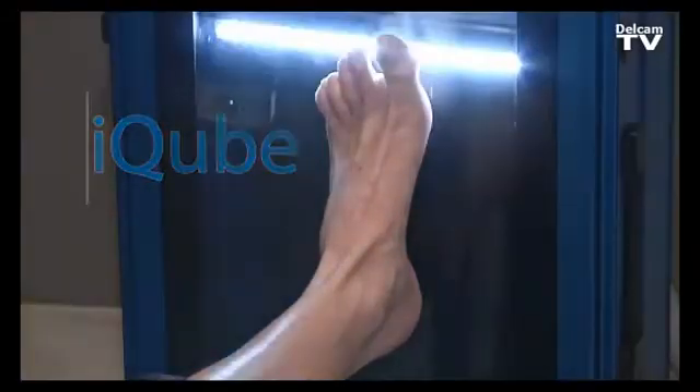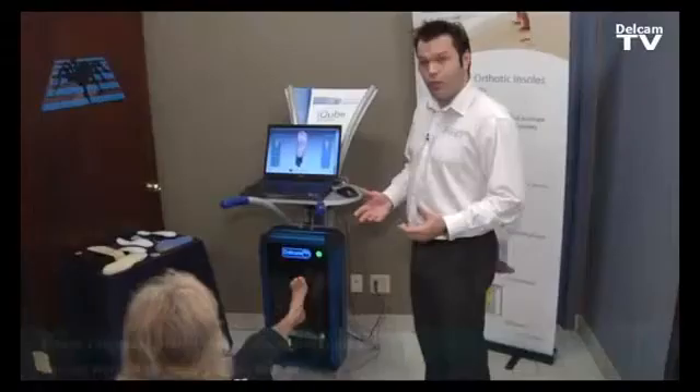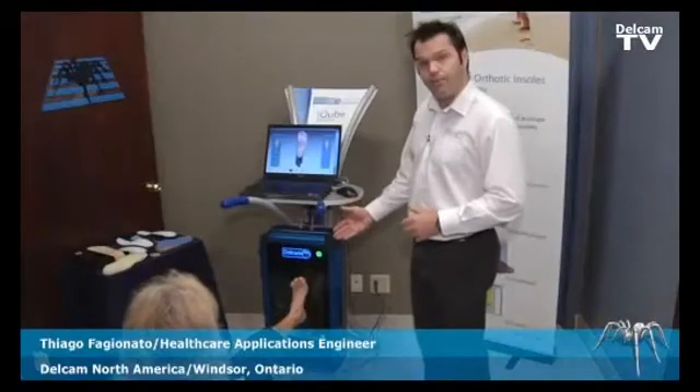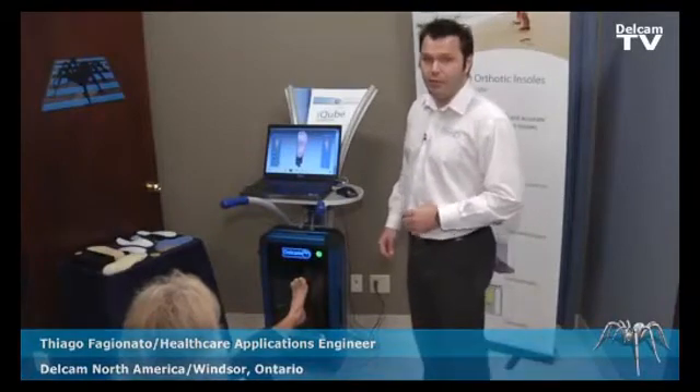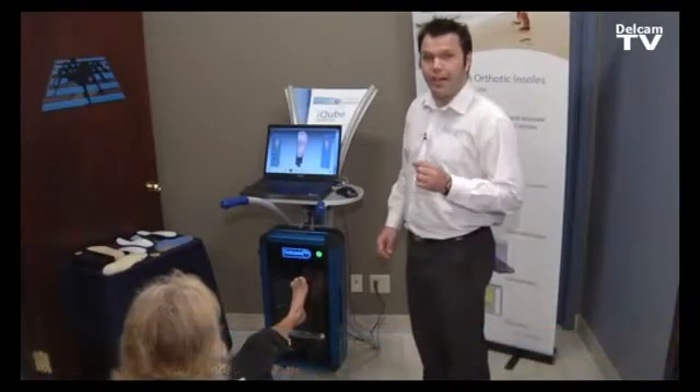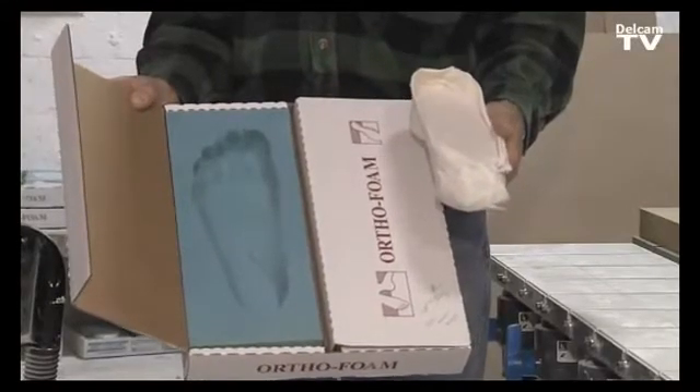The iQube station allows us to use the iQube scanner in three positions: a non-weight bearing scan, a semi-weight bearing scan, and a full weight bearing scan. It also allows us to scan a crush box and a cast that comes from the practitioner.